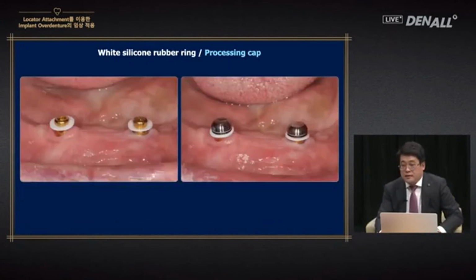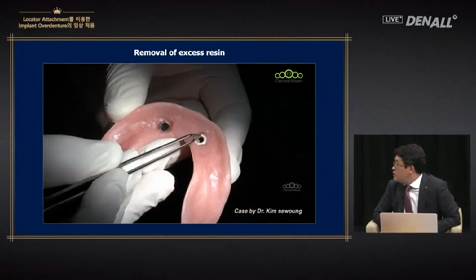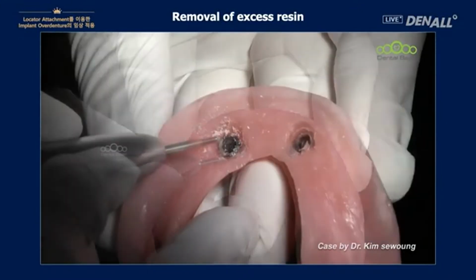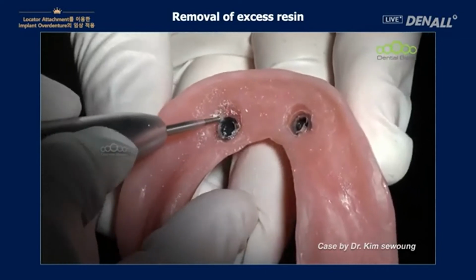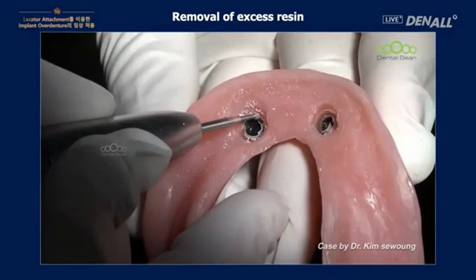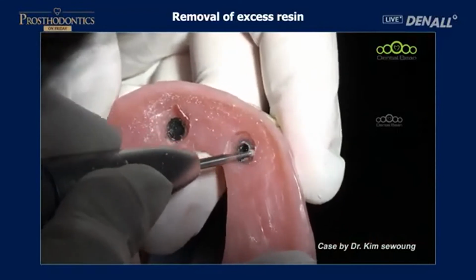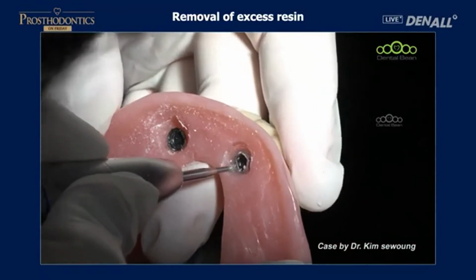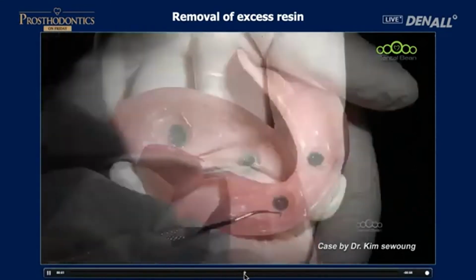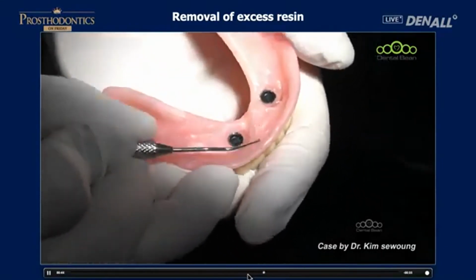Let's look again. This is the same process. We remove. Because the color is the same, you don't really know what is the excessive resin, and you trim the surroundings slightly. Trimming. As you can see, it is removed very easily. Yes.